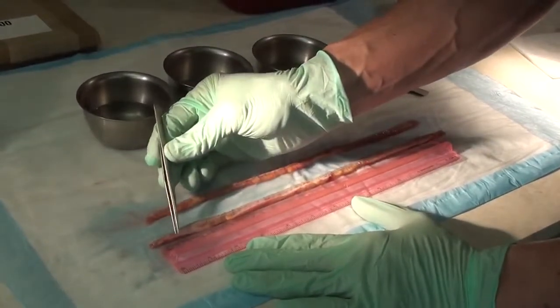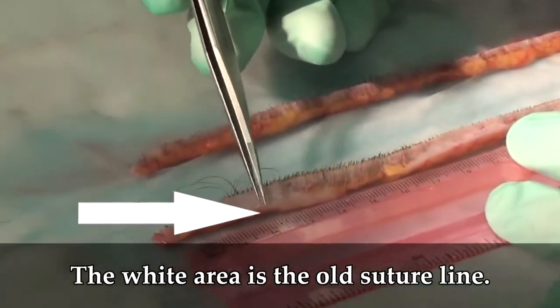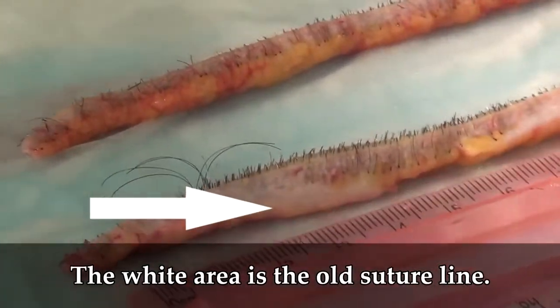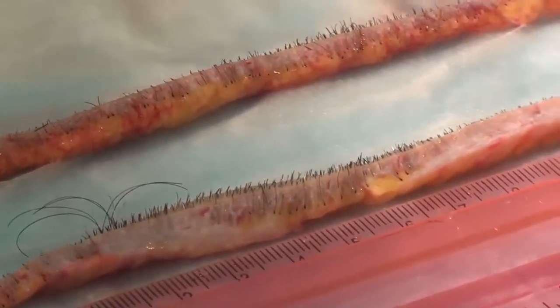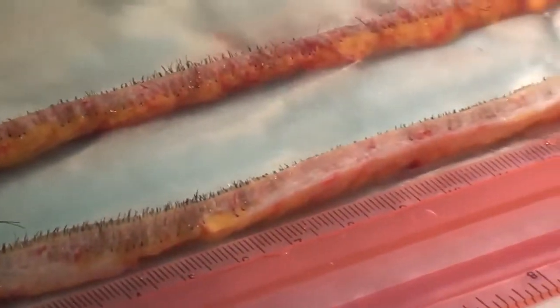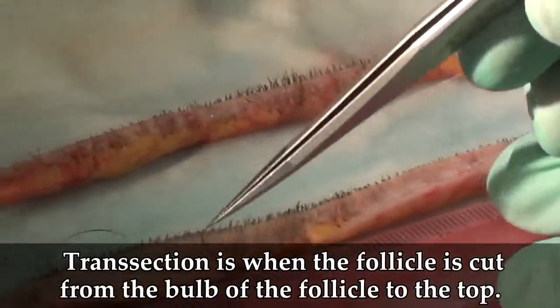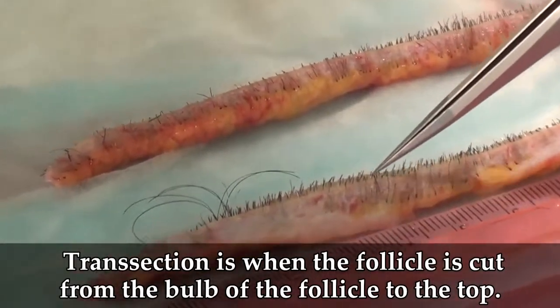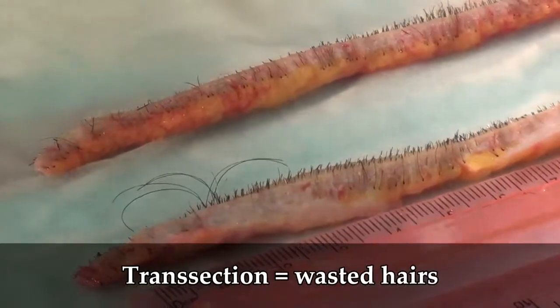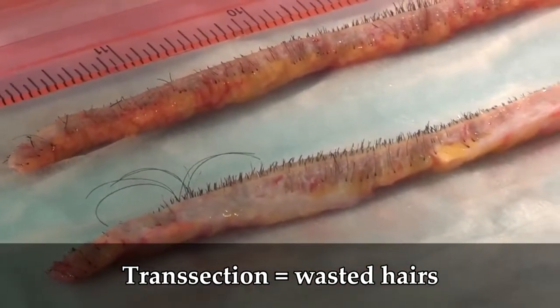Now when you take a look here, you'll see this little white area. The little white area is where we dissected out the suture line, the previous one. So that's just some initial scar tissue. What's very important about the donor tissue is when you're harvesting it, you want to minimize any and all transection. Transection is when a follicle is cut from the bulb of the follicle to the top where it comes out at the surface of the skin. So by minimizing the transection, we maximize the overall amount of hair by increasing the overall yield.